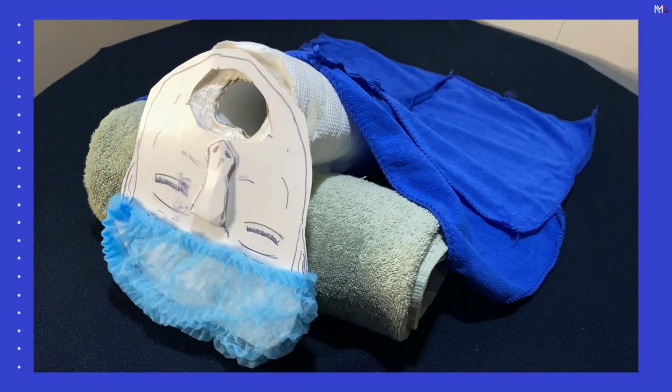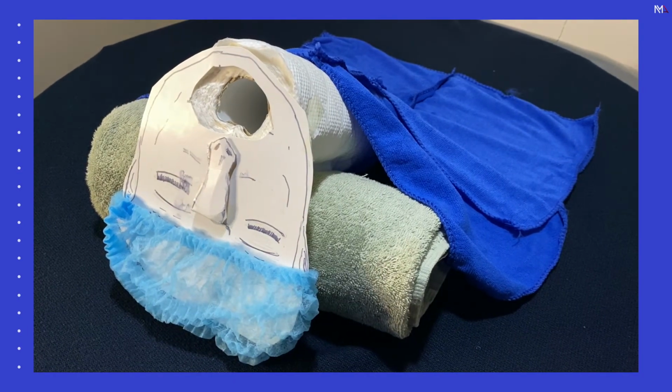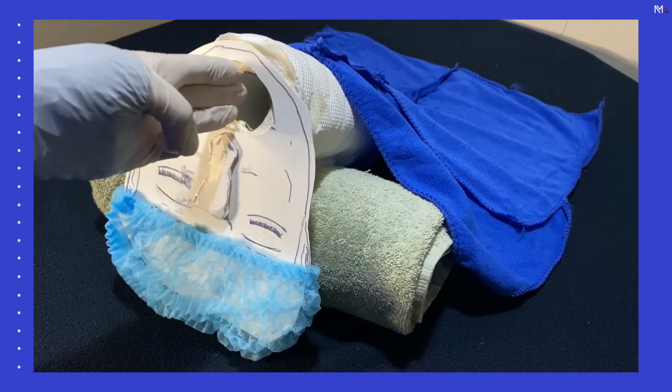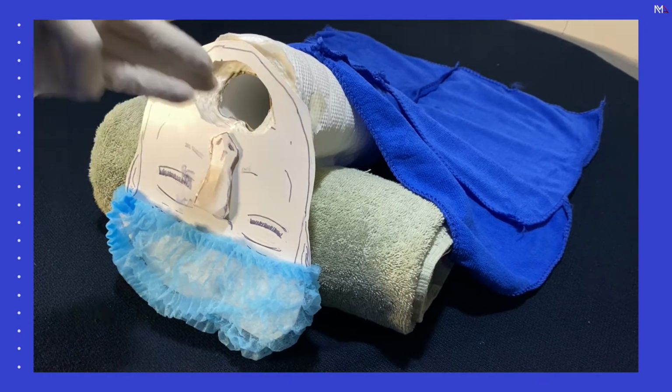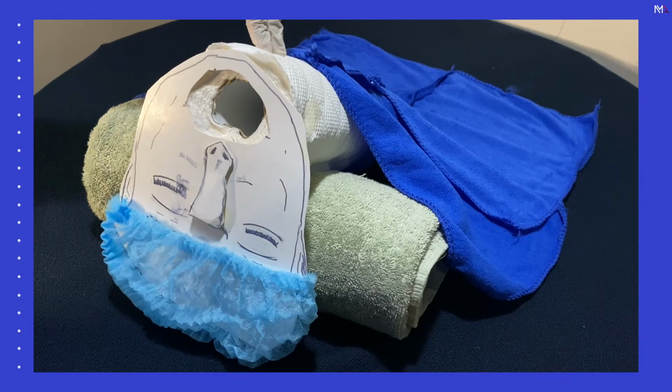Evaluate by using the 3-3-2 rule. Can the patient fit 3 fingers between the incisors? Is the mandible length 3 fingers from the mentum to the hyoid bone? Is the distance from the hyoid to the thyroid 2 fingers?